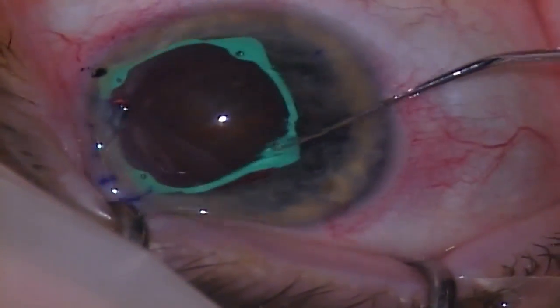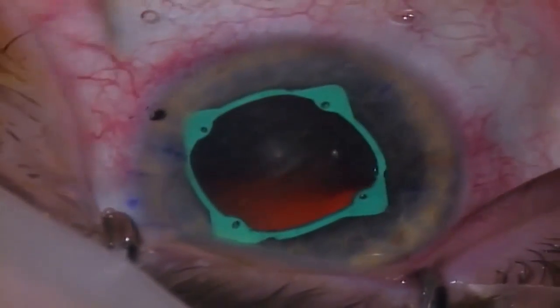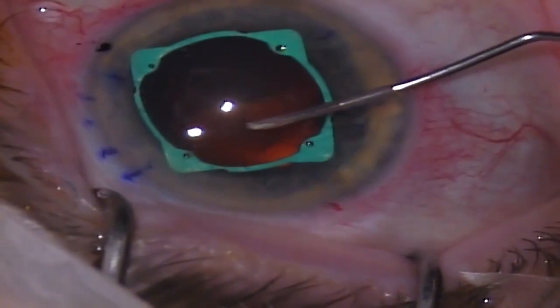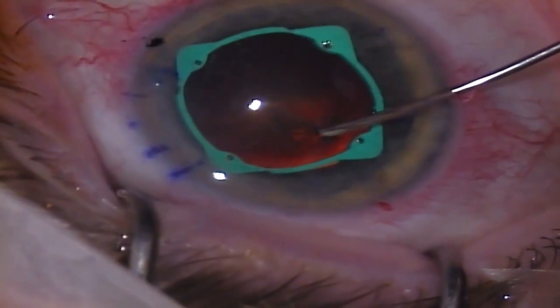Next, I use the Sinski hook to place any channels that have not been engaged. The next step in the procedure is to create a capsulorhexis. Notice the low profile of the beams of the eye ring does not interfere with the creation of the capsulorhexis.